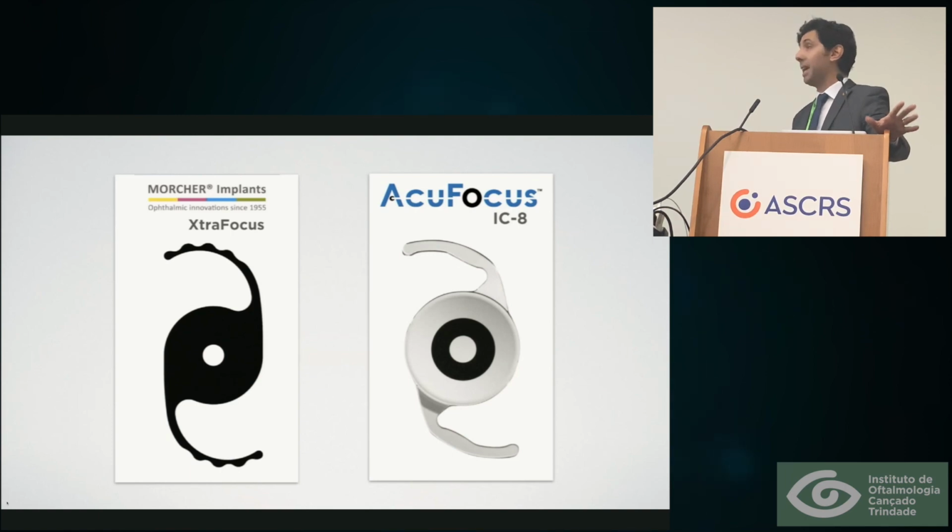I like to call them implants because the left model, the XtraFocus, which we are going to cover mostly during this course, is not an IOL. Technically, it's a diaphragm. It has no refractive power. It's just a pinhole with a 1.3 millimeter opening, whereas the AcuFocus is an IOL itself with an embedded pinhole mask.